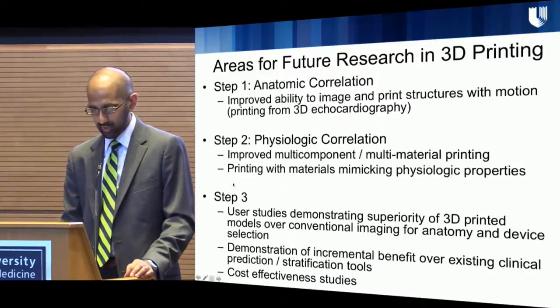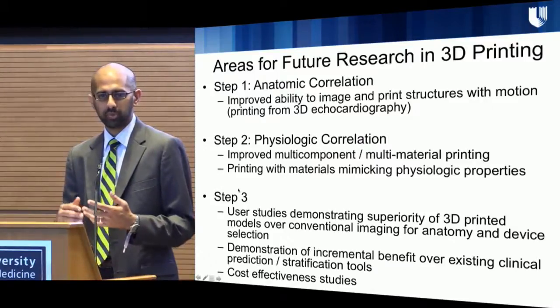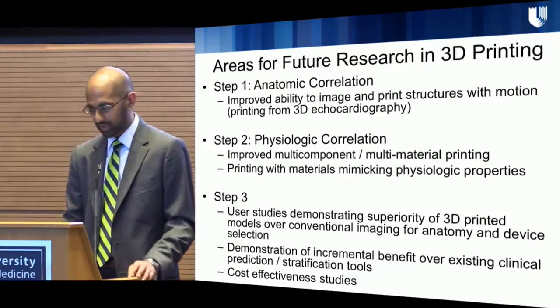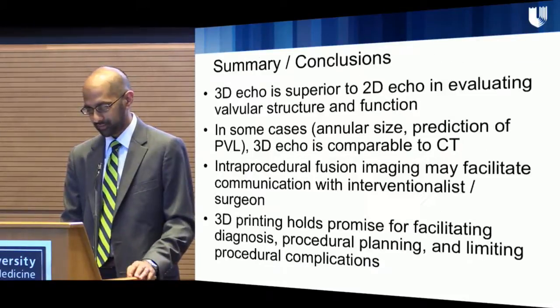And then we really are beginning to enter step 3. We need to actually show that we can improve either people's ability to understand the anatomy or actually improve some sort of surrogate outcome by using 3D printing. And then that will need to move to cost-effectiveness studies.